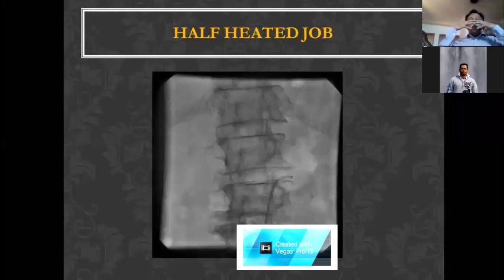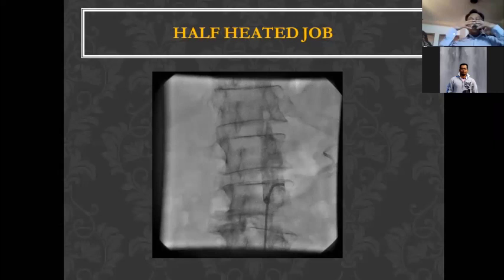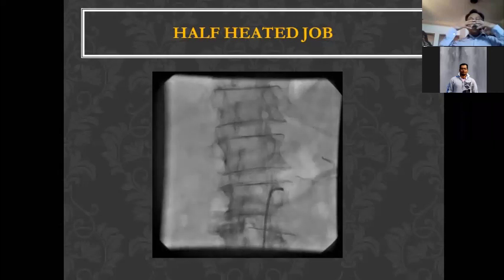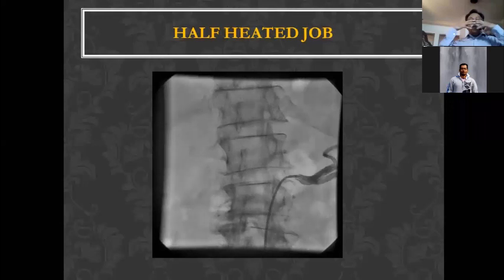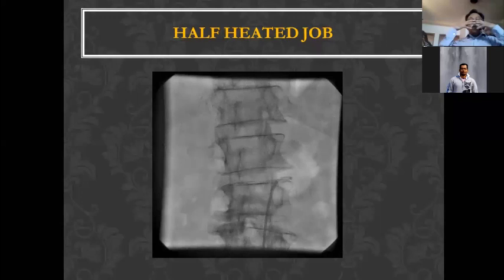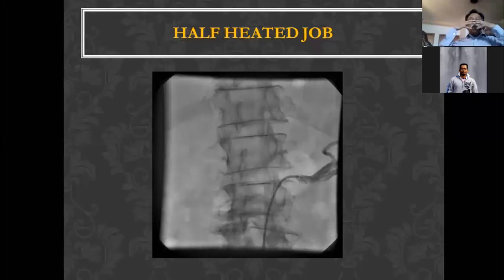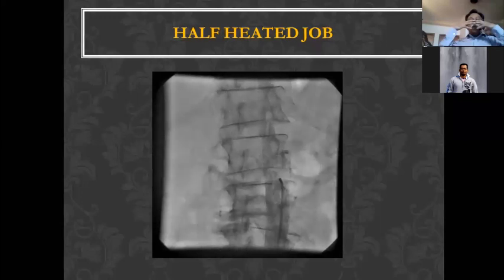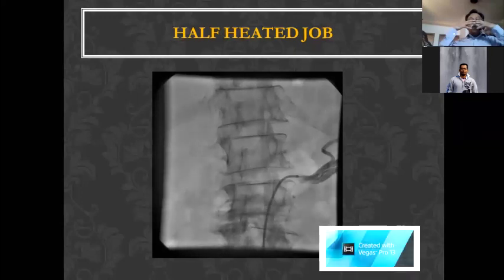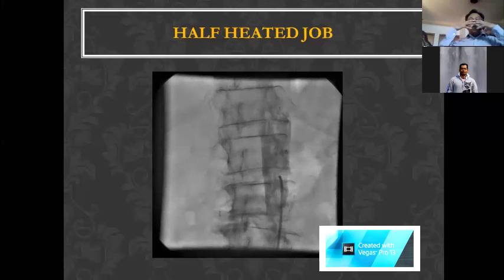For if the patient next time comes with hypertension, and if you feel that could be because of renal artery stenosis, with this angiogram, you may not give any opinion. But if you have done it properly, definitely you can explain, no, this is not because of renal artery stenosis. This is essential hypertension.